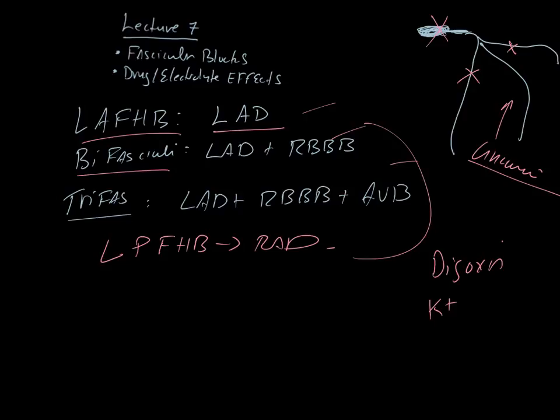Are you guys okay with what hyperkalemia looks like? Okay, the classic finding is a tall peaked T wave. And it's symmetrical, right? And it's fairly symmetrical, yeah. It's not as asymmetrical as a benign early repol. You guys okay with that? All right. Good. And you'll see that in multiple leads, right? Yes, you see that in multiple leads.